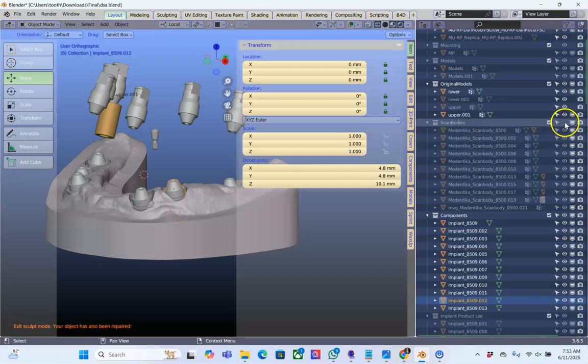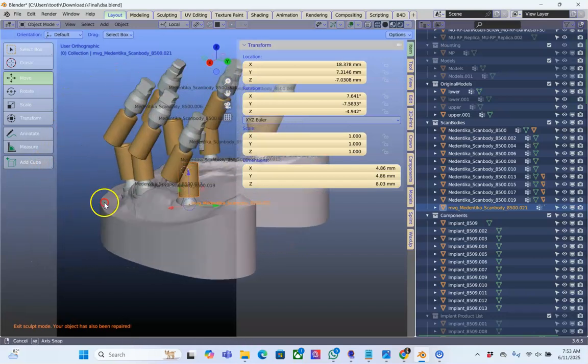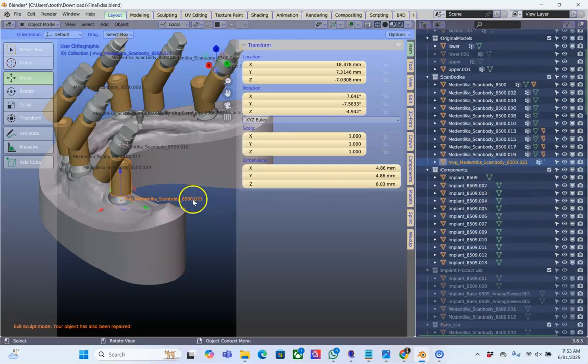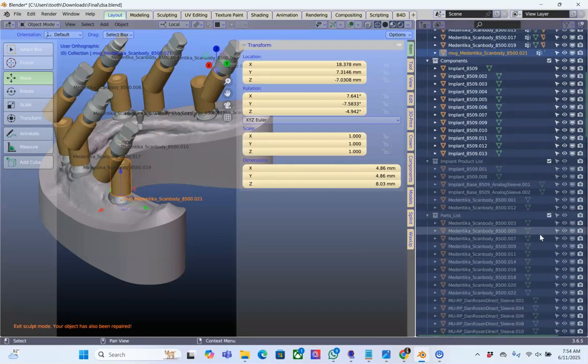These all have a rotation axis here, so we can use those. And this is exactly what I'm going to do. But I need to find the parts first. Now this is usually done after we make the model, so this hasn't been done in this case. So here we've got implant product lists.